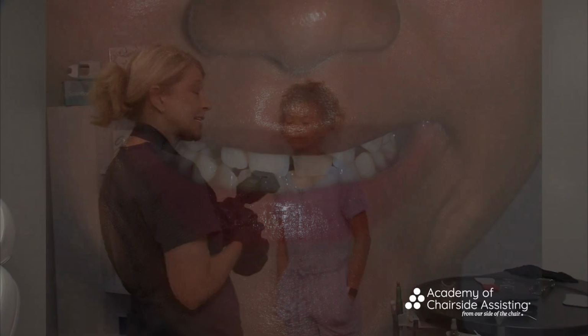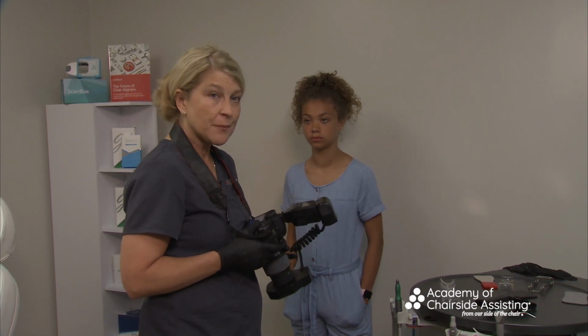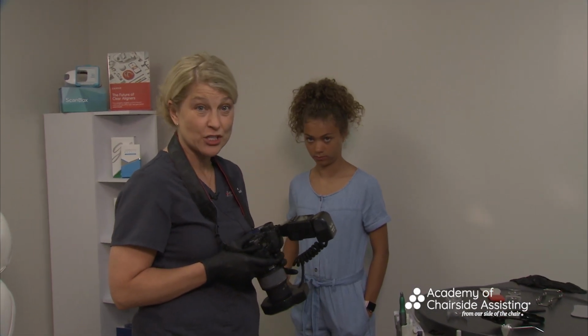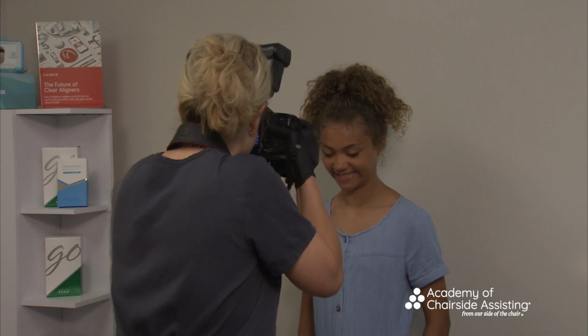So the next photo that I'm going to take is a tip down. We'll talk again more about that in the lab communication. But the tip down is where the patient actually brings their head down and they smile really big, because we're looking at the relationship of those incisal edges to the lip. So even though we're not going to do any aesthetics on Kylie, I'm going to take the photo anyway just for demonstration. So Kylie, I want you to tip your head down and I want you to give me a really big smile.